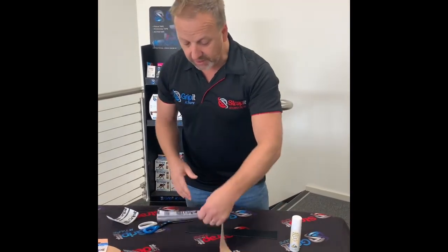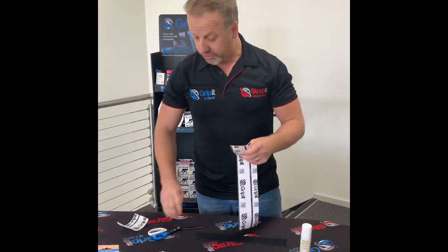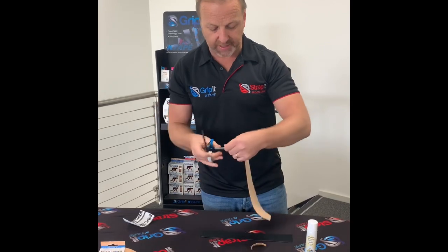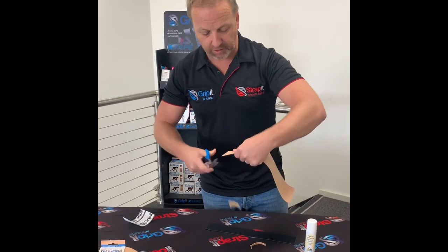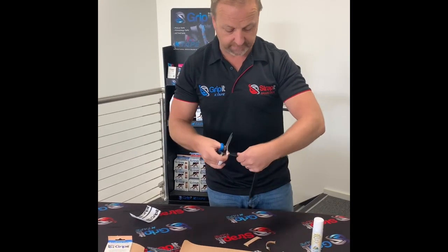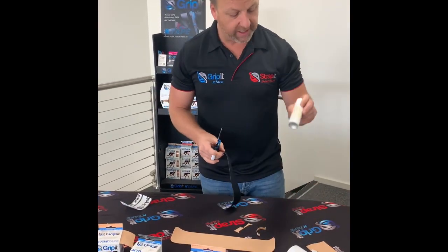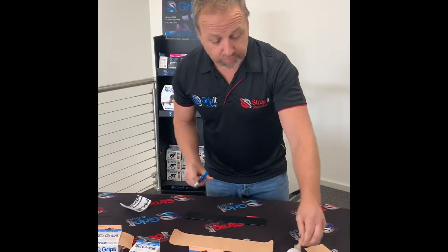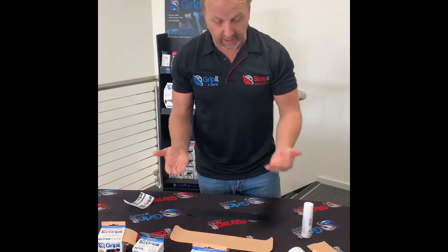The second thing is with whatever size, single layer or 2 layer or 3 layer, we like to round the edges. We round the edges because that means that on application, there's no sharp edge that has the capacity to come off. So whatever you do, you round the edges. This is a double layer with the edges rounded, and here's a single layer we'll prepare, again rounding the edges. When you are preparing, you also have the option to apply a pre-spray adhesive onto the skin to make the tape stick a bit better. So they're the preparation principles. Just remember, 2 layer, laminate before it goes on the patient, and single layer is very straightforward.